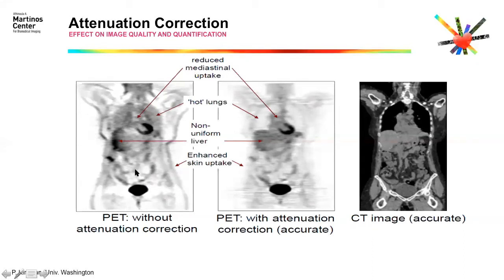And you will realize that deeper inside the body, we have less activity than it really should be, because deeper inside the body there is more dense matter around to get those gamma rays out of the body. So the more the chances to get either absorbed or scattered.